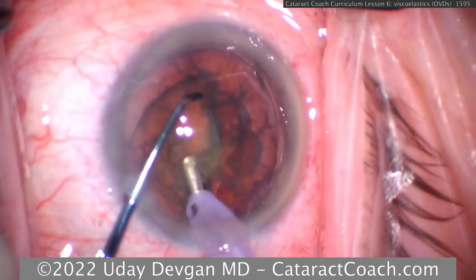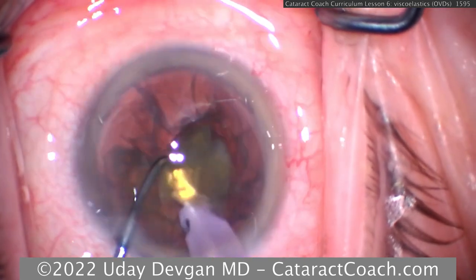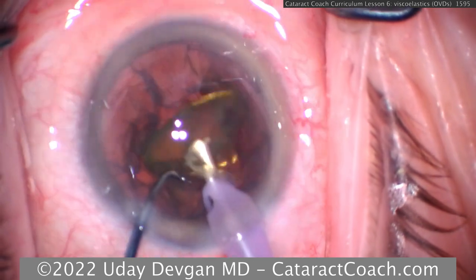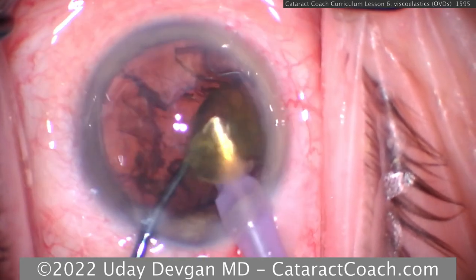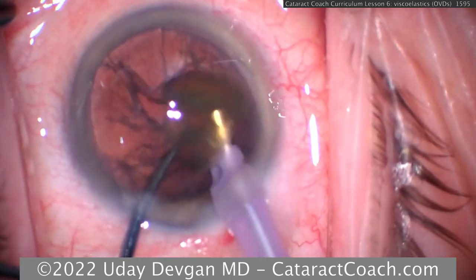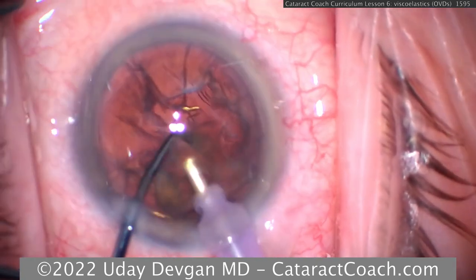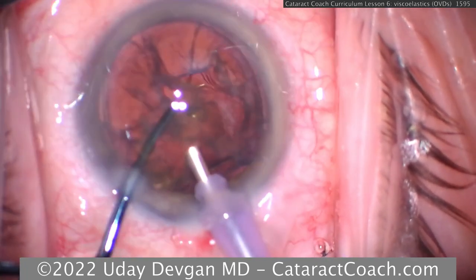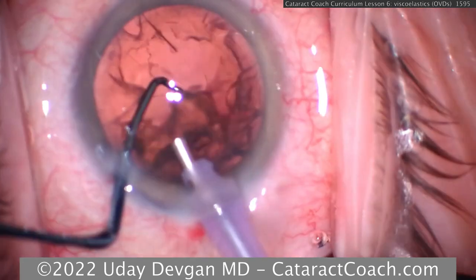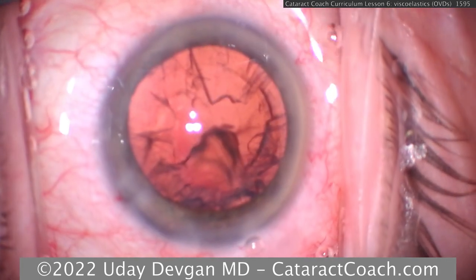Now, cohesive OVDs are more solid than liquid. They have the consistency of a gelatin, which means they can't really coat or flow as well. But because they're much thicker, they're able to maintain space and pressurize the eye quite well. This is useful to keep the anterior chamber formed, let's say while you're inserting an IOL, to keep the capsule flat during rhexis creation, to move or manipulate iris or other tissues. And again, even keeping vitreous back, it can be helpful.